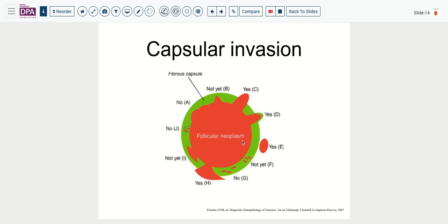Separate island of tumor outside of the follicular neoplasm, yes, presumably you've just cut through this at a different plane, or this in a different plane. So this also represents such a thing. And sometimes this pattern of spread is what I've referred to as the mushroom cap spread. Seeing this incompletely through the capsule is concerning, but does not of itself qualify as invasion, and therefore may still be a benign lesion or technically benign. And these other patterns likewise do not qualify as invasion.